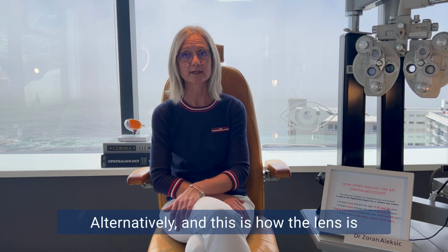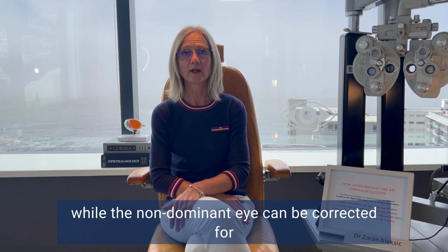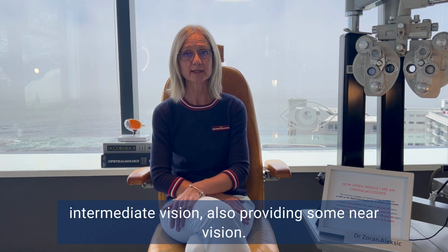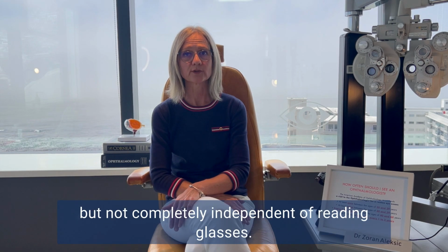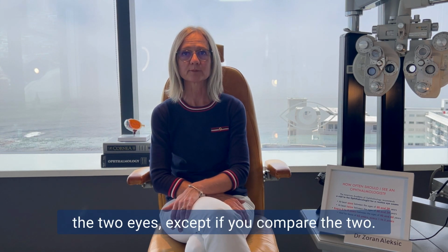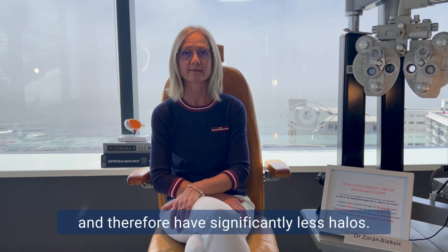Alternatively, and this is how the lens is used most often, the dominant eye can be corrected for distance vision, also providing intermediate vision, while the non-dominant eye can be corrected for intermediate vision, also providing some near vision. Creating this slight offset between the two eyes aims to make one less dependent on glasses, but not completely independent of reading glasses. One is usually not aware of this slight difference between the two eyes, except if you compare the two.